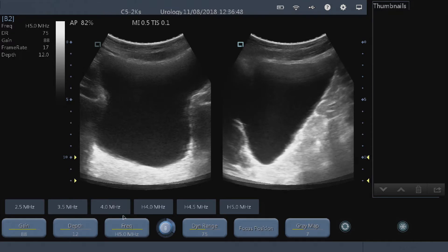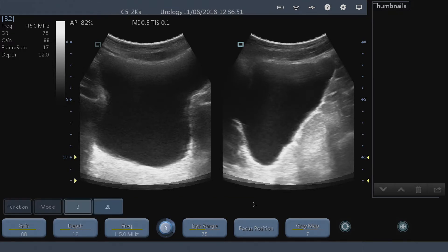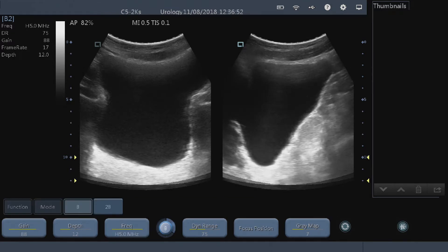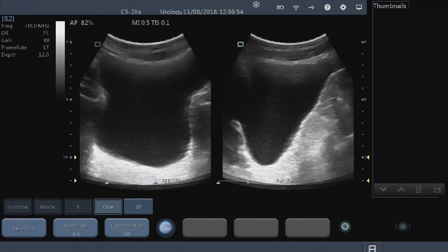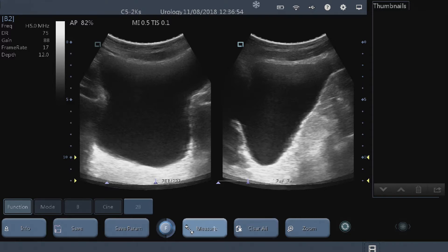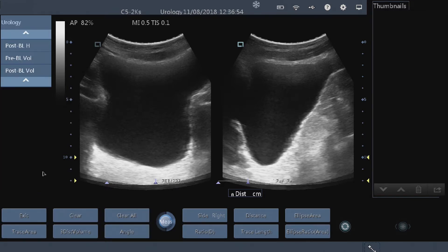Once we have the image, we go freeze and then function measure. Because we're in the urology preset exam, we have all of our urology measurements on the left hand side menu here.